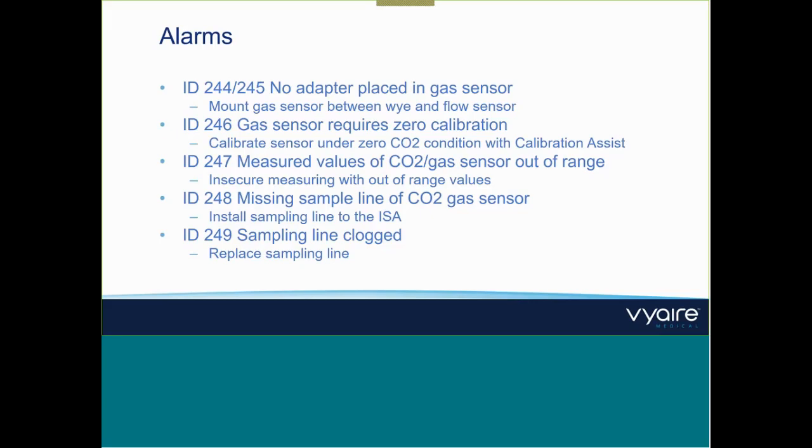As I said, it really depends on what you're after. If you're just fine with having End-Tidal CO2 measurement, and you want to protect your capnometer, and you have adult patients, so you don't have to care about the aspirated air taken by the side stream device, side stream is fine. So it's mainly used in anesthesia, where you won't expect leakage as well, and you don't non-invasively ventilate the patient. So this is the perfect use for a side stream. But if you want to have additional information, a better CO2 curve, and want to analyze more, and also have the chance of volumetric capnography, I would always recommend mainstream measurement.